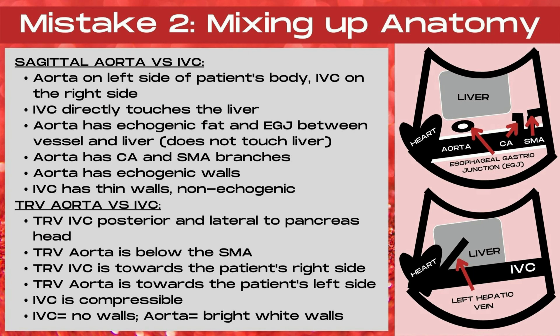Also look for the branches. The aorta has the celiac axis and also the superior mesenteric artery branches. The aorta is also going to have echogenic walls, while the IVC is going to have thin walls that are non-echogenic. We call this 'no walls' in ultrasound imaging.